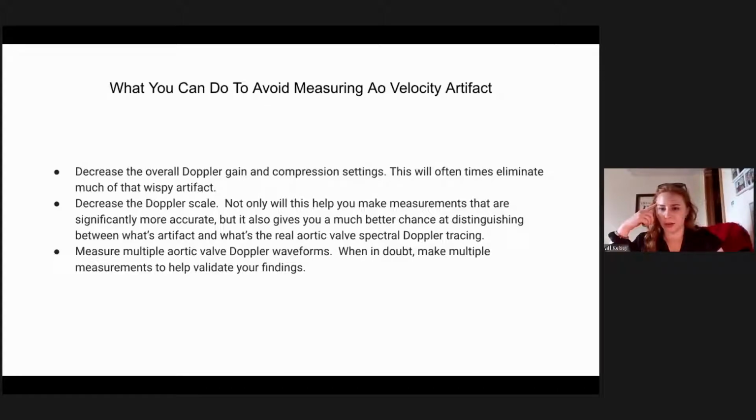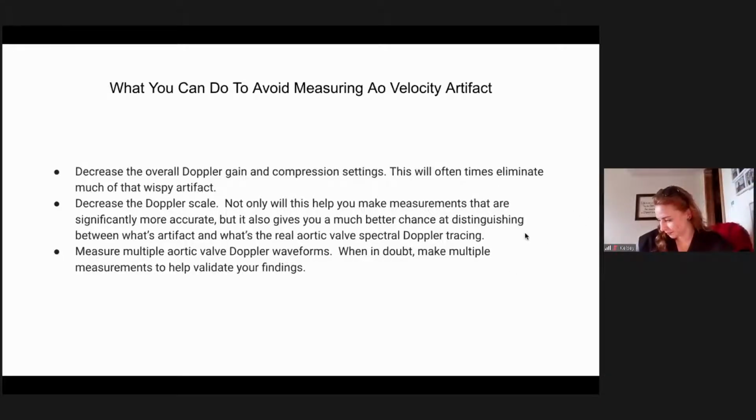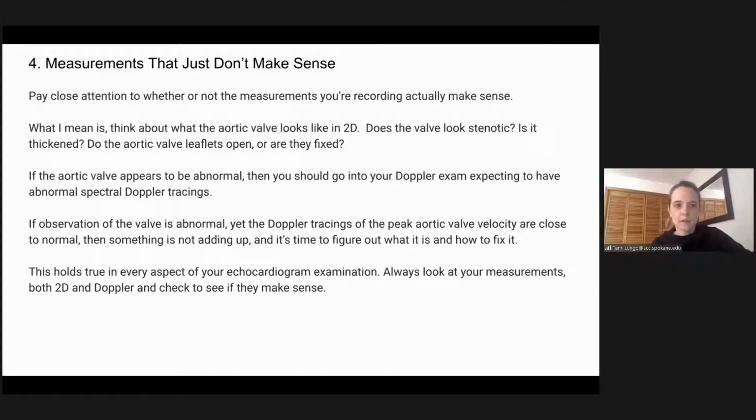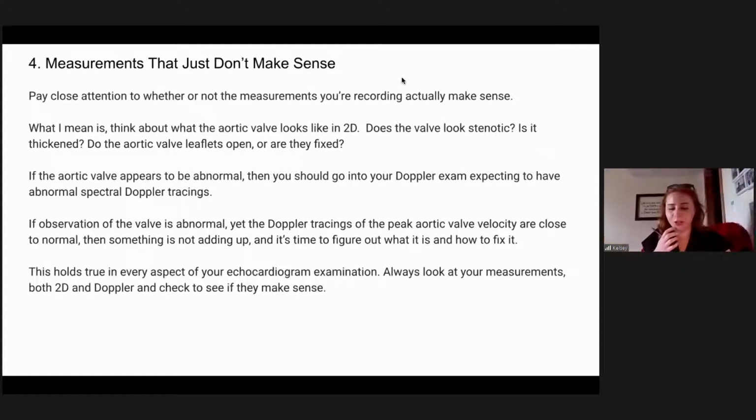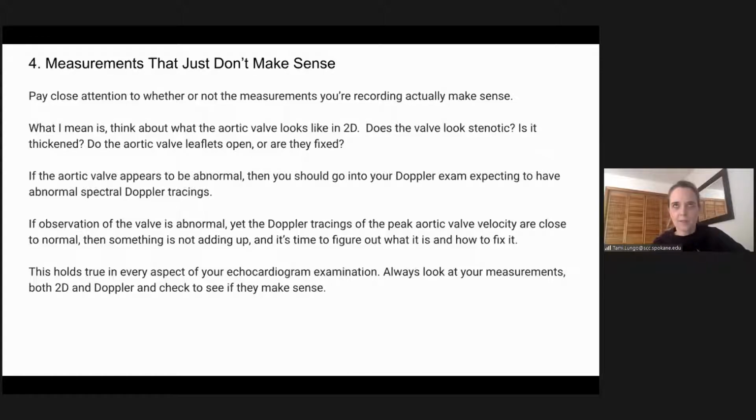We just work with machines that are a little bit older here. Yeah, my auto LVOT always takes 3. And then the other ones we don't do auto on, but yes, it'll take 3. And I think anytime it's automated, they always pick 3. You guys have kind of older machines for sure. Well, that's something to look forward to. You guys will definitely be surprised at what you can see when you're out in the real world.